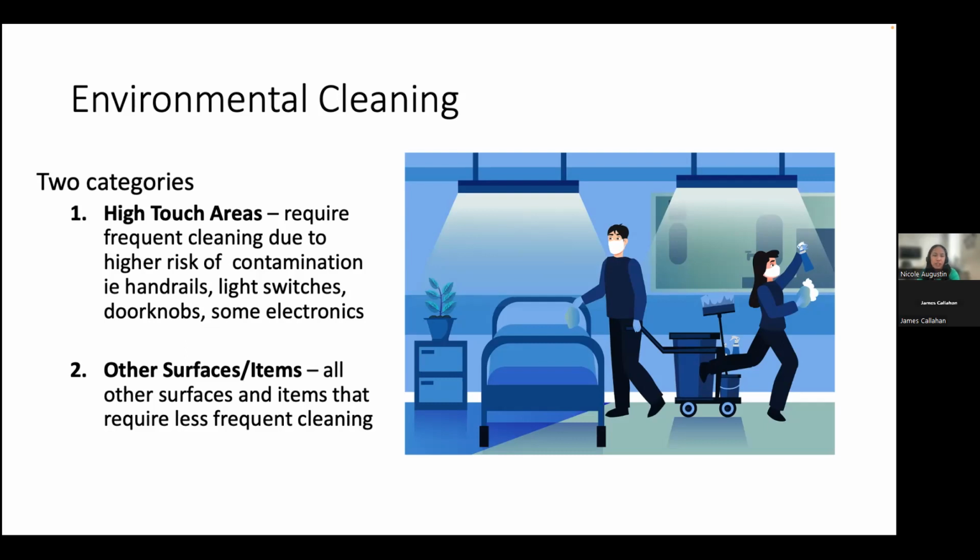Number 2, other surfaces and items. All other surfaces and items require less frequent cleaning, partly because they pose lower risk as being a source of infection or transmission.